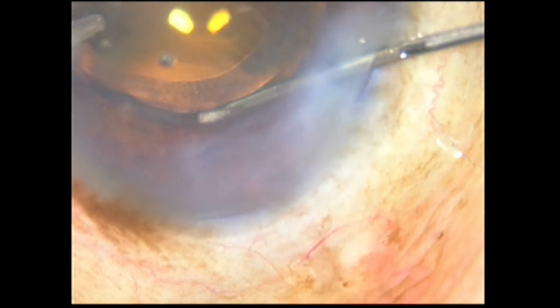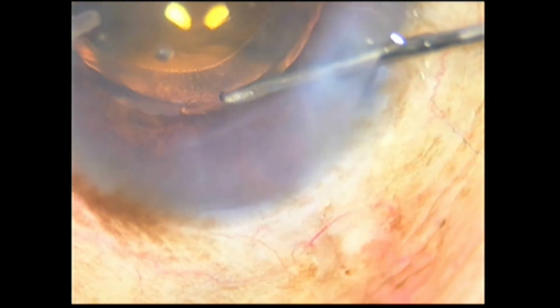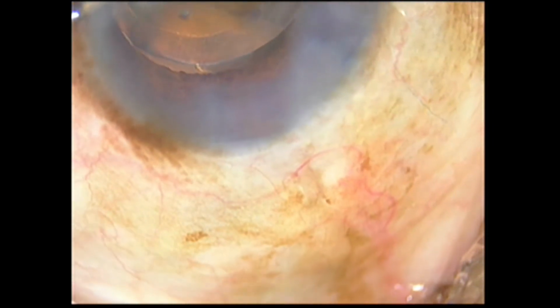In patients at high risk for capsular bag distension, like those with a smaller rhexis or a sulcus fixated IOL with optic capture, or those with greater axial length, a peripheral anterior capsulotomy is created using a 26 gauge needle after IOL implantation. This is done under continuous irrigation. This creates a communication between the bag and the aqueous, reducing the chances of capsular distension syndrome.